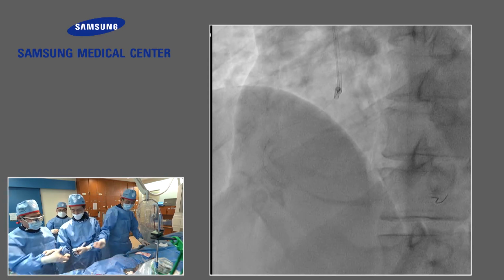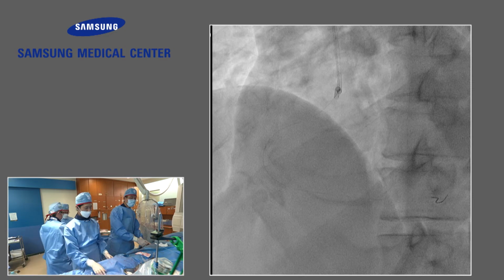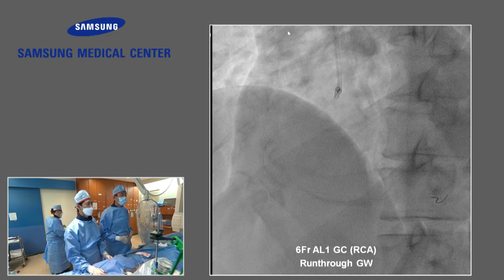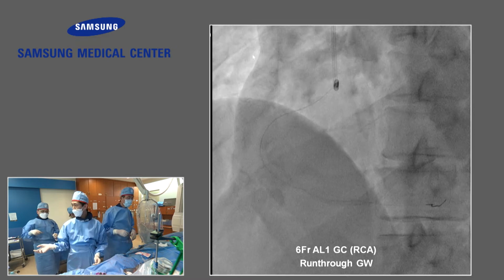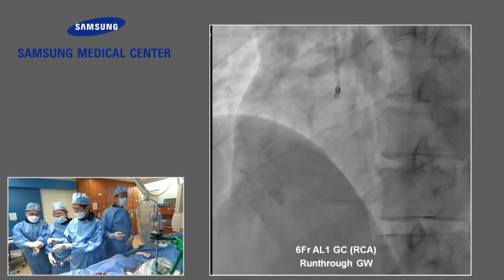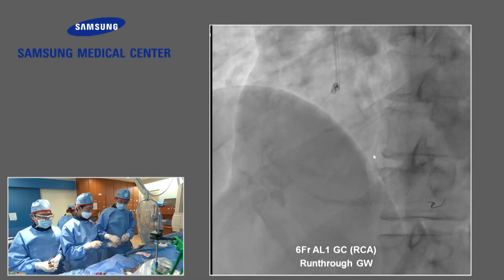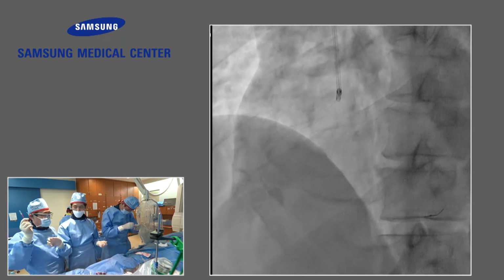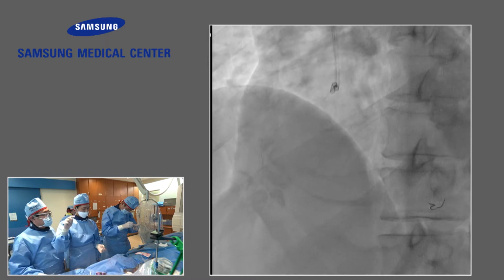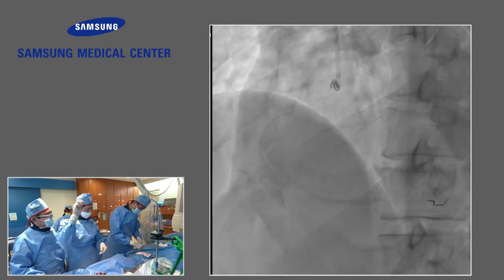See that? Years ago, at SNU hospital, we used that balloon maneuver with a 1.5 to retrieve the microcatheter with the wire in situ. And Dr. Lee, at that time, was impressed and propagated our know-how to some medical centers.